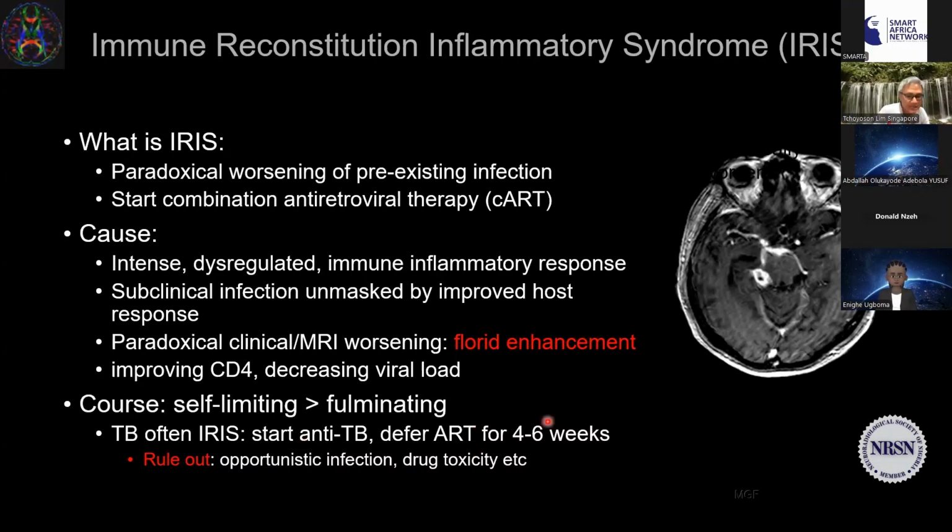because you need to rule out, in a situation that looks like IRIS, whether there is an opportunistic superinfection or drug toxicity. So I hope I've made myself clear, because this is sometimes very confusing and very difficult to make a diagnosis of IRIS.